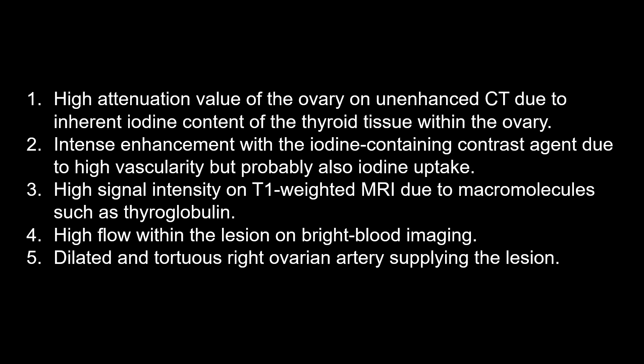Third: the high signal intensity on T1-weighted MRI, due to macromolecules such as thyroglobulin. Fourth: the high flow within the lesion on bright blood imaging, which is counter-intuitive if we consider an ordinary case of ovarian torsion. Fifth: dilated and tortuous right ovarian artery supplying the lesion.